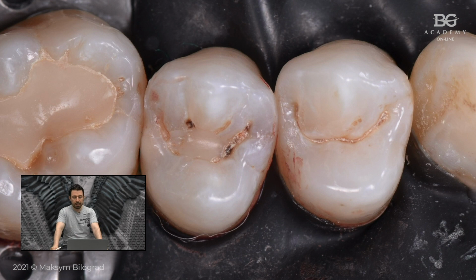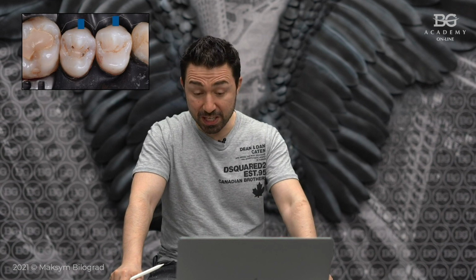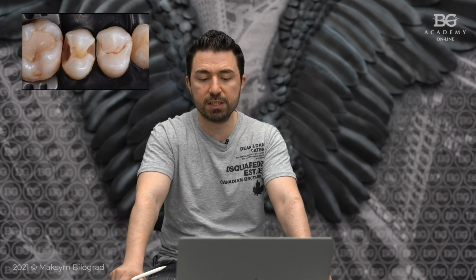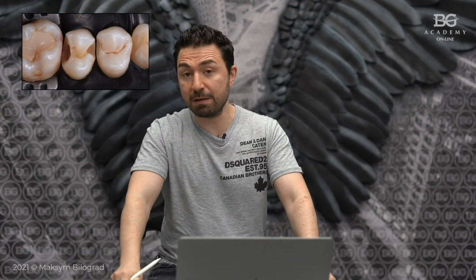Premolars. Let me show you the premolars because they are pretty interesting. Since the position of these premolars allows us to be additive, we don't need to prep them from the vestibular side. We just make, let's say, a finish line. But there is always a but in dentistry. There are caries defects here. So we have to prep. After caries excavation, we have that kind of starting point, let's say.